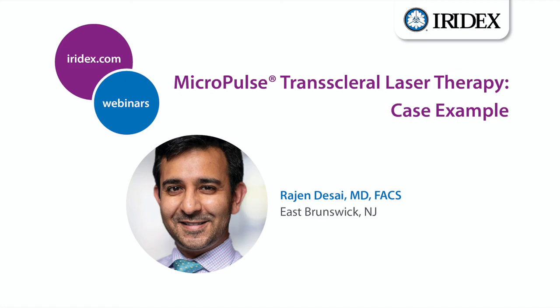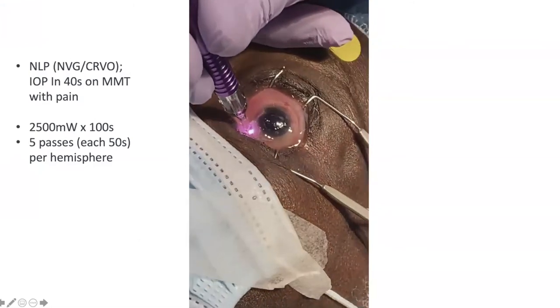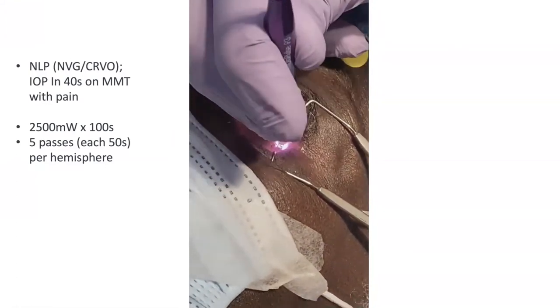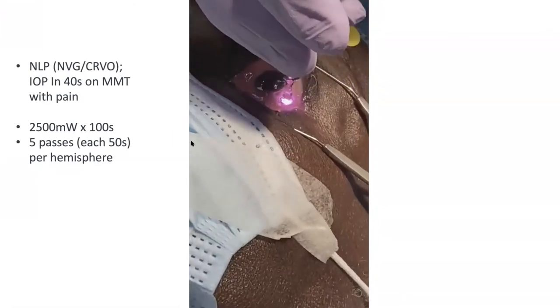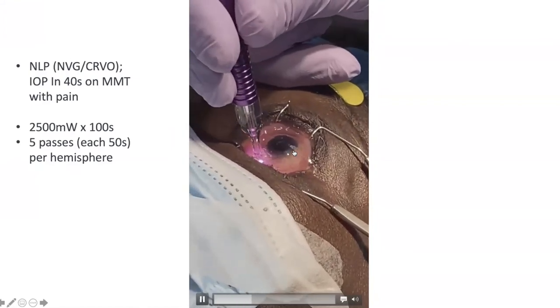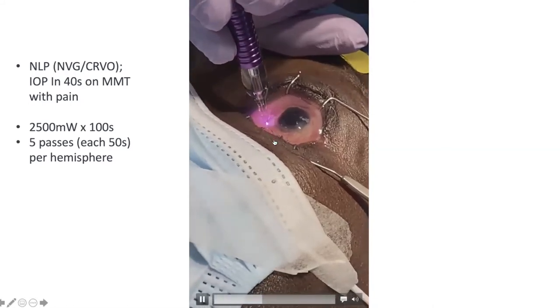Is it good to draw and mark the area in millimeters behind the limbus? No — do not use a marker. The 810-nanometer wavelength is absorbed by melanin, and if you use a marker, the ink will absorb the laser energy and nothing gets deeper into the ciliary body. The footplate is designed to sit on the scleral part of the cornea — avoid the clear corneal area entirely. You don't have to mark anything, and in fact you can't, because a marker will ruin the treatment.